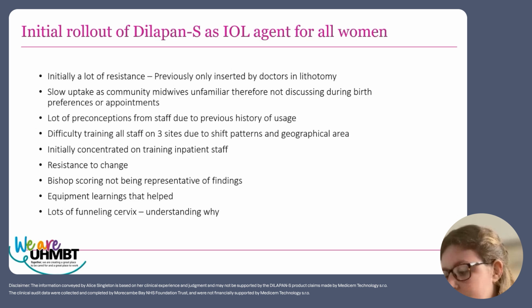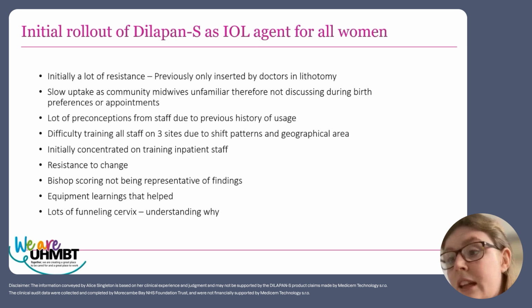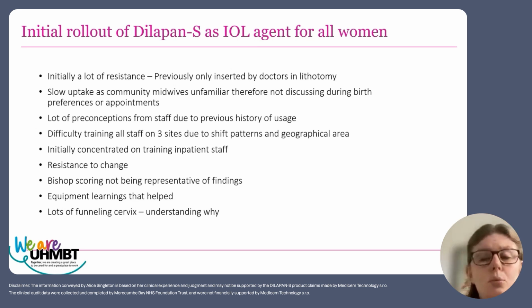Another thing that flagged up was that Bishop scoring just wasn't working with Dilapan. It wasn't representative of people's findings. As Hannah very kindly explained at the beginning, Dilapan works by osmosis. It basically dehydrates the cervix, which causes the Dilapan itself to expand and grow and keep continual pressure on the cervix. Dilapan doesn't have the same effect on the length and the effacement of the cervix as we were used to with prostaglandins and ProPess, for example.